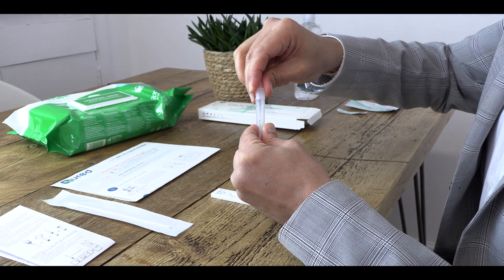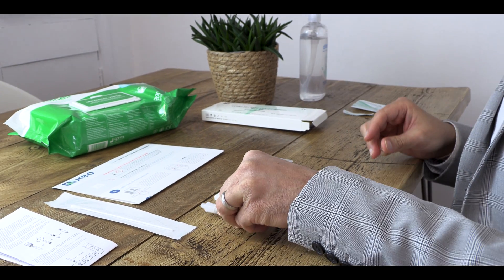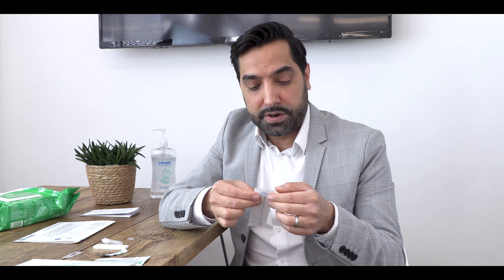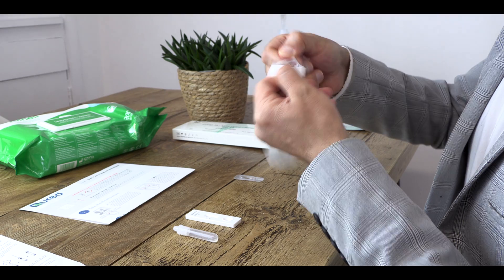Replace the lid back onto the extraction tube and place it on a flat surface. The next step is to open up your sterile swab. There'll be an arrow on the back to guide you where to open it from, and you want to make sure that you don't touch the soft cotton wool bit at the end of it. Keep it ready to be used.